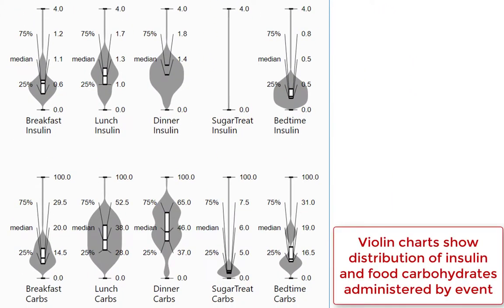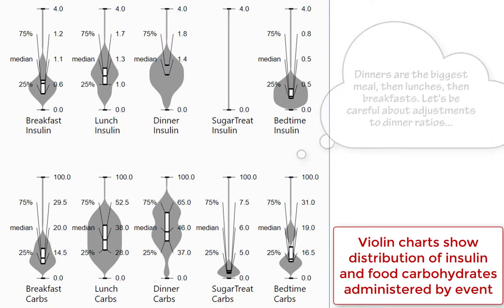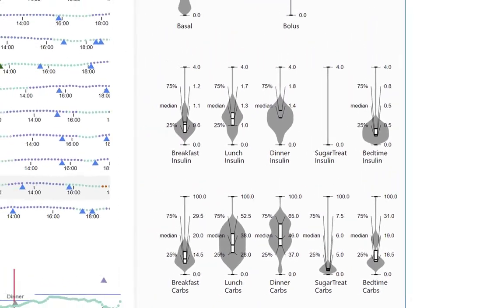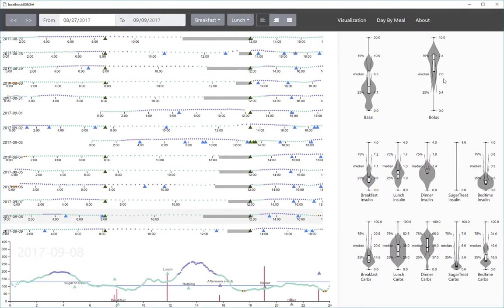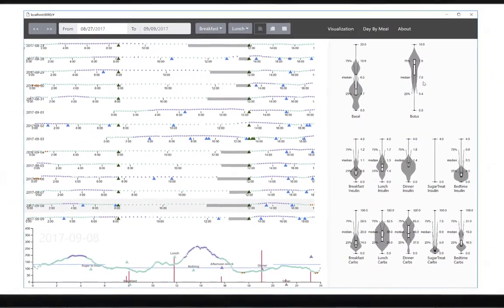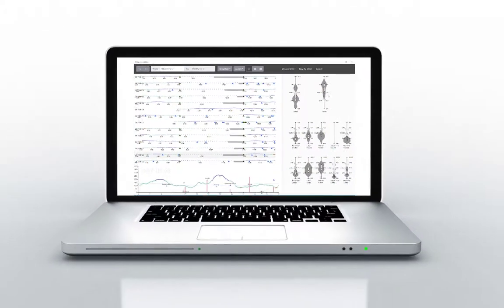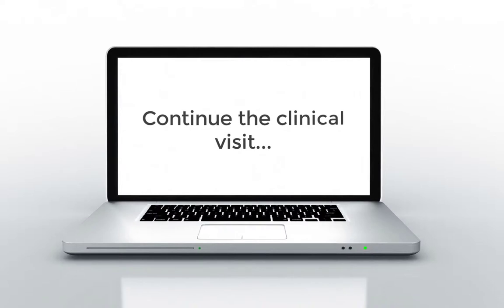Looking at food and insulin for particular meals, we see that dinners tend to be large and varied. We should be careful adjusting dinner ratios as they could have a big effect. All right, let's write up our treatment plan and continue the clinical visit, and let's plan to check in with our patient in a week to see how well the changes worked.